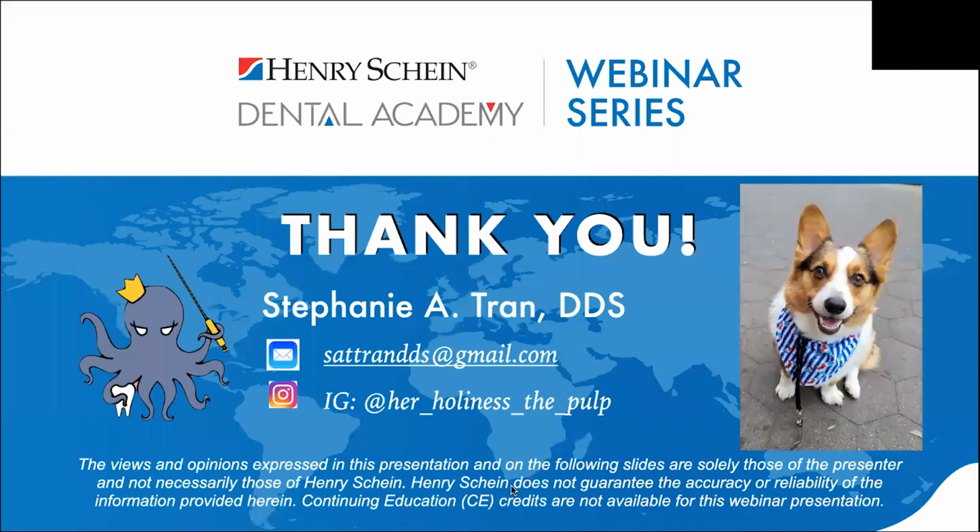Can the tooth sleuth, is that how you pronounce it? Yeah. Can the tooth sleuth be used on a tooth with an existing crown to test for a fracture? Yes, actually, it's very helpful for that, because even though there's a crown on it, what you're doing is localizing the pressure onto a specific cusp, and you're trying to see if there's release pain or pain upon biting. So what kind of pain there is and when. It also does help you localize if the pain's on the mesial or distal or where it is. So yeah, it can be done.